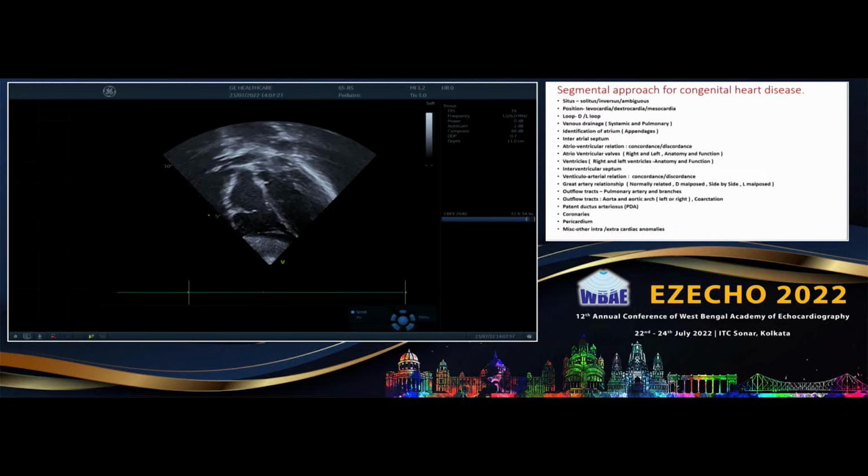So septal attachment of the AV valve is more in favor of a tricuspid. Another thing is the right-sided ventricle, that is the RV. Another prominent feature in the RV is the moderator band, and the tricuspid valve is apical to the left-sided AV valve.